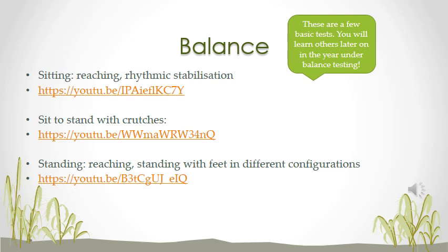So you will here find resources for testing sitting balance, where you will ask the person to reach and do rhythmic stabilization, then sit to stand with crutches. How to do it is also a resource.